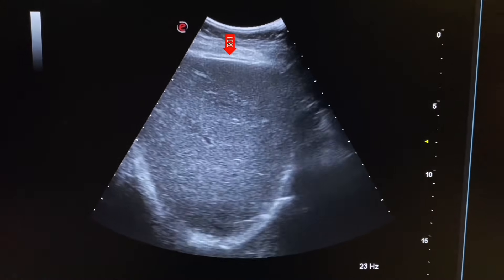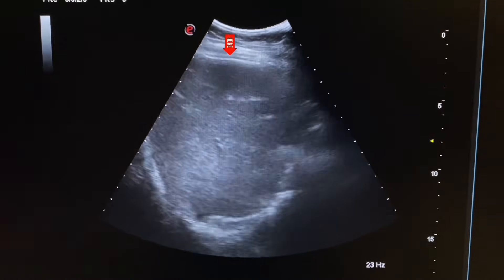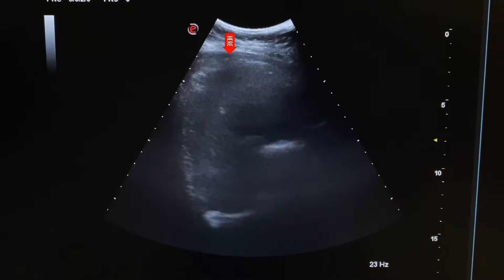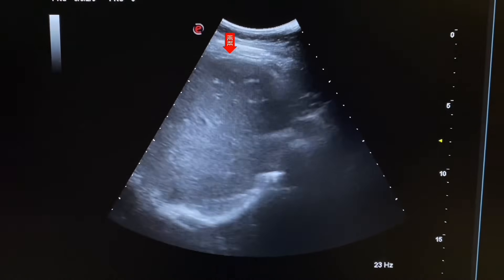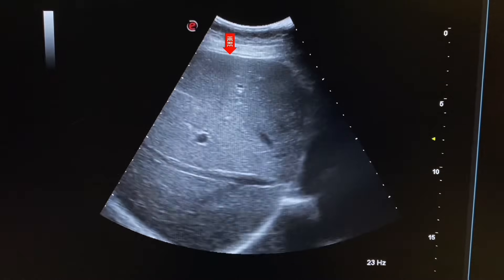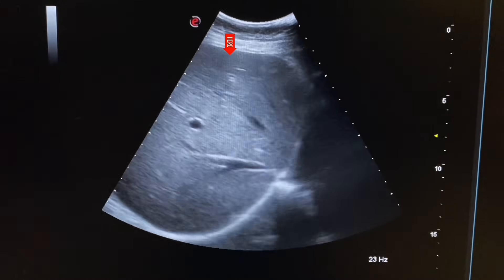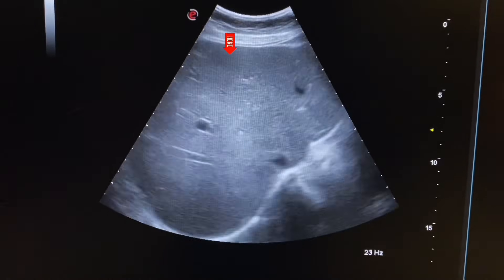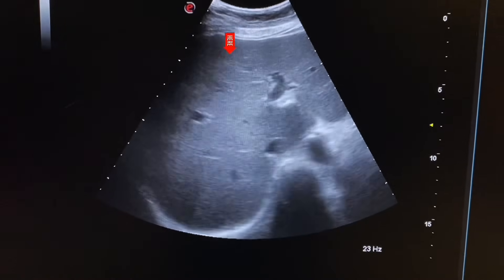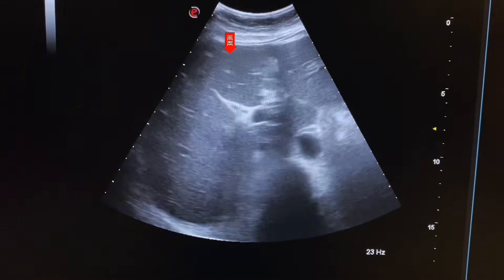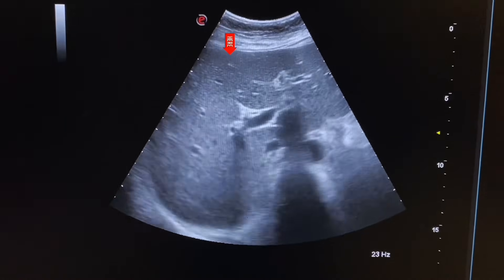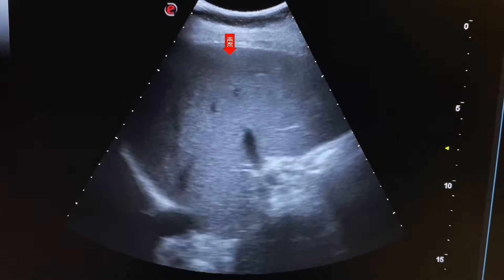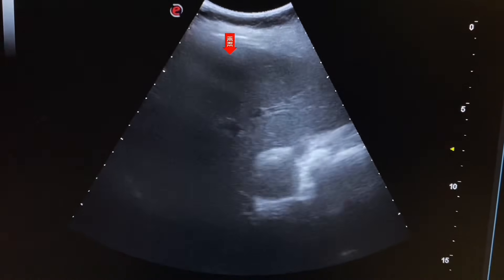When we place the probe at an oblique position from the epigastrium towards the right hypochondrium, we get this view of the right lobe of the liver. The texture of the liver is smooth and slightly echogenic. No mass lesions are seen.